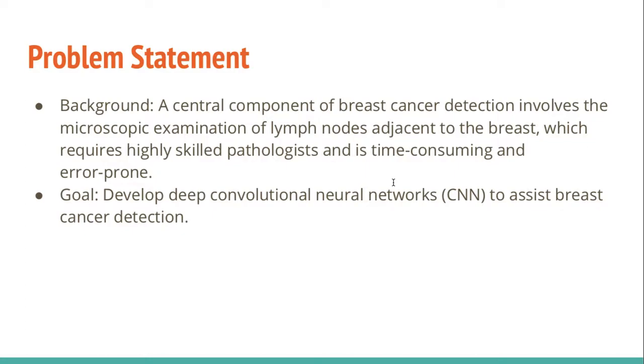So, a central component of breast cancer detection involves microscopic examination of lymph nodes adjacent to the breast, which requires highly skilled pathologists and is really time consuming. So the goal of the project is to develop deep convolutional neural networks to assist breast cancer detection.